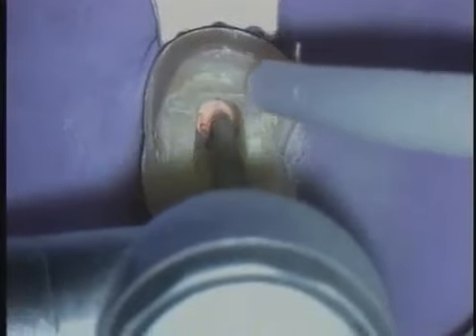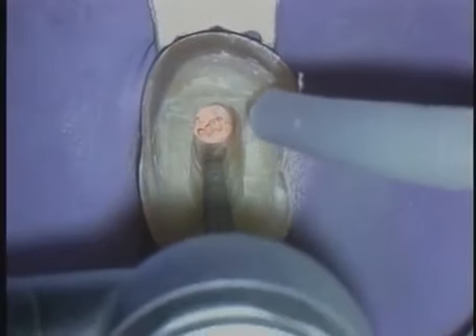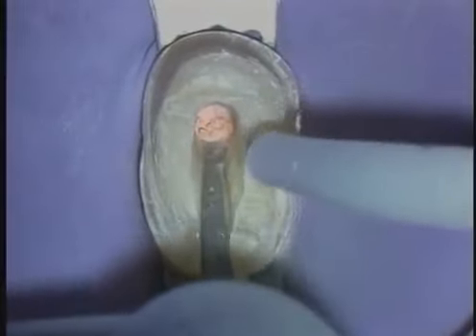Surgical length diamonds true up axial walls, and flat axial walls refract light better to the observer. This means our vision's enhanced. With that wall trued up, you can begin to see a little bit of indication of some material or the suggestion of a second orifice. Notice how we carry that wall to the lingual. We can begin to see that it makes sense that that orifice would be there because it's about evenly centered between the lingual and the orifice containing gutta percha.